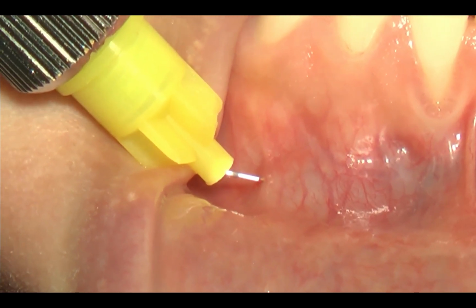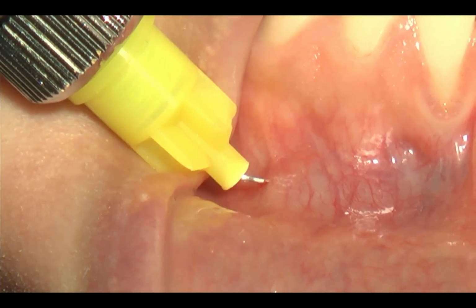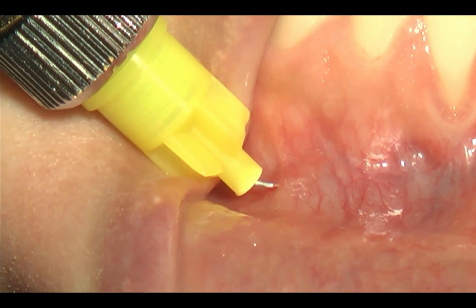Now you can see that the needle is almost completely inside the tissue. It means that I'm taking anesthesia in the area of the pedicle.